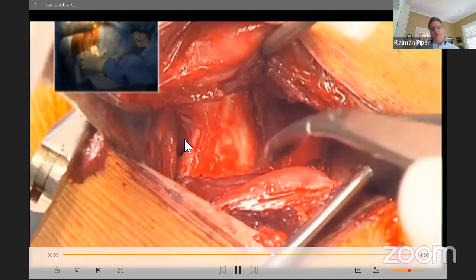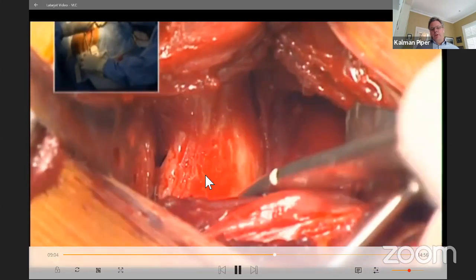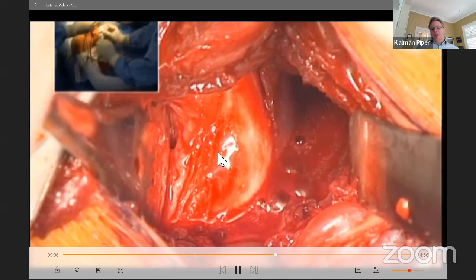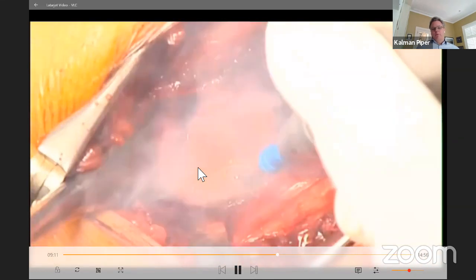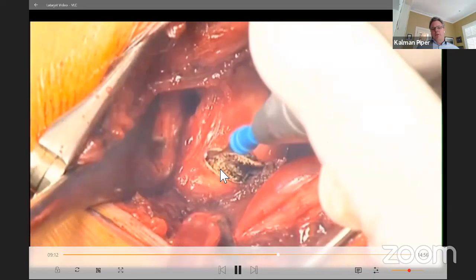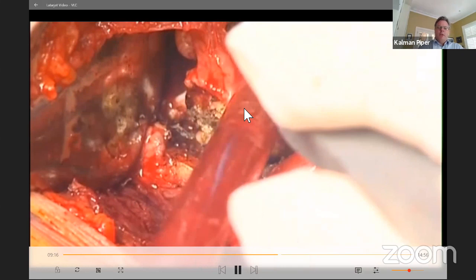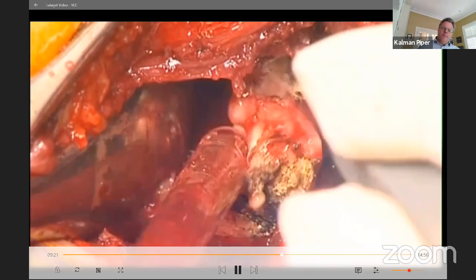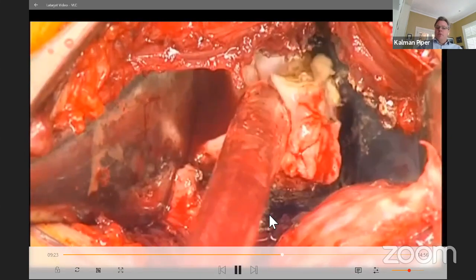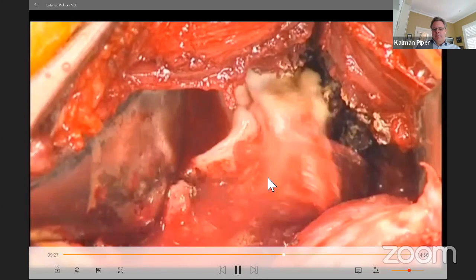He's done a vertical capsulotomy here, but the remaining capsule on the actual medial glenoid neck, or periosteum, I guess, needs to be removed to expose the underlying bone. So a little window of periosteum and capsule is removed. And this is where you'll see a Bankart fracture if they have one. That's a Bankart fracture, I think, in there. That Bankart fracture I remove, and it's demonstrating the labral tear, and this is the Bankart fracture here.